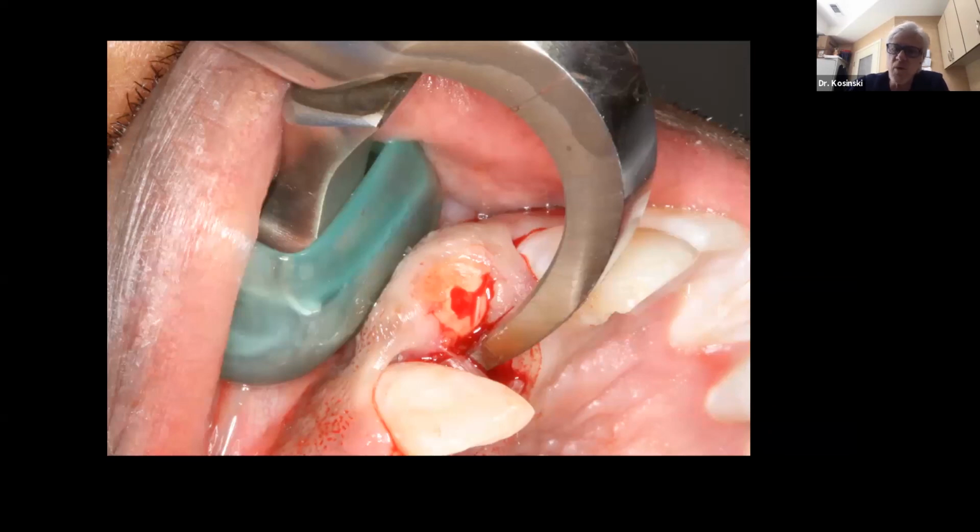That tension is going to result in a physiologic reaction of the body. The body will release an enzyme which will break down the periodontal ligament. What's holding this tooth in position, doctors? Periodontal ligament, right? So if we're able to remove the periodontal ligament, this tooth will pop up and out of the socket with very, very little force. I'm maintaining the mesial and distal hard tissue and hopefully the facial plate of bone as well.